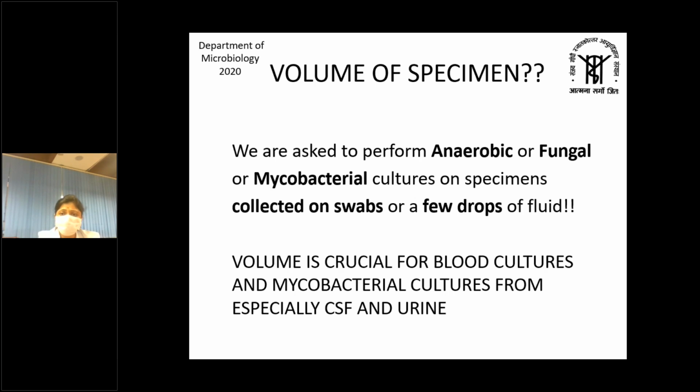Or if I am doing a lumbar puncture for CSF, then I have to take absolute aseptic precautions and avoid any contamination of the sample. So the first very important principle for collection of a microbiology sample is strict asepsis and least contamination by the skin flora or the environment.